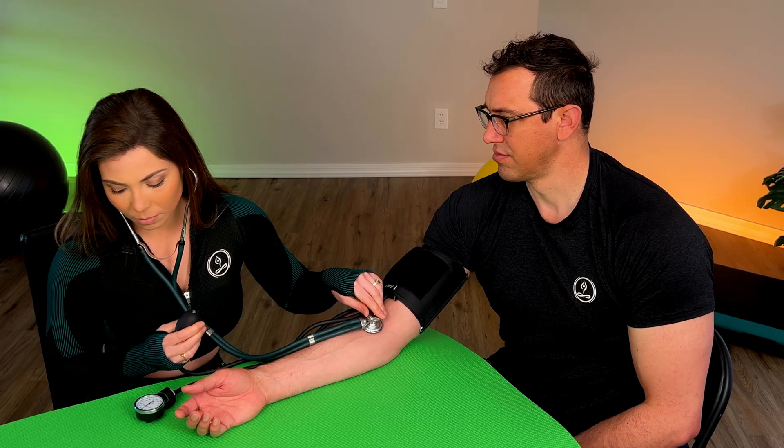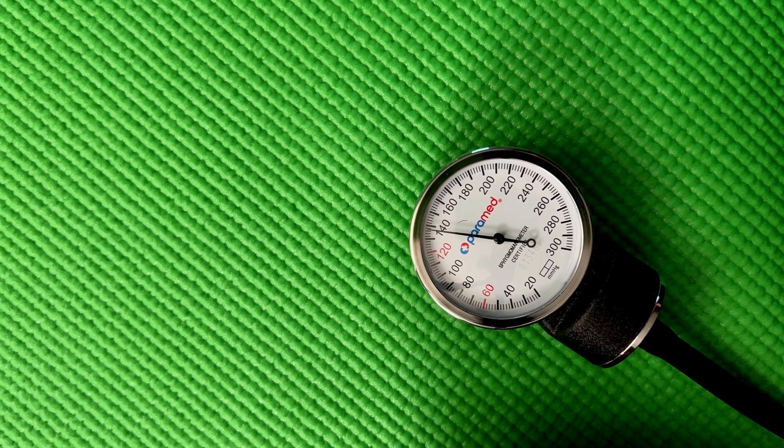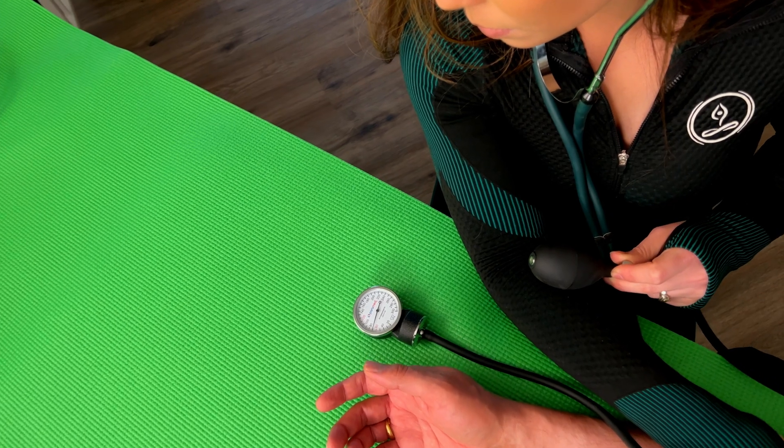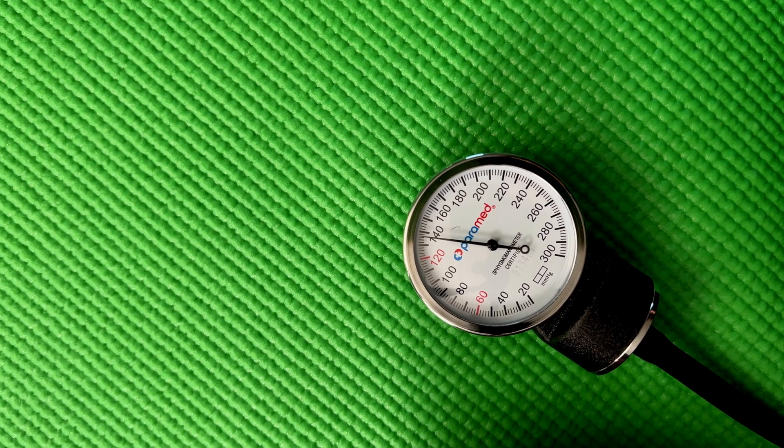The bottom line is you want to inflate the cuff until you don't hear any beat. One tip when you are inflating the cuff: make sure that the valve is actually closed, because if it is not, the air will just leak out and the cuff will never inflate. So if you're sitting there pumping it wondering why it isn't inflating, it's possible that the valve is open. Now you've got the cuff pumped up and the stethoscope placed on the artery. Now it's time to start releasing the air slowly from the cuff by unscrewing the valve very slightly and slowly. You don't want to do it all at once because then you're going to totally miss the reading — it must be very slow. A good pace of releasing the air should be about two millimeters of mercury per second. If you're releasing air faster than that, it's possible that you could miss hearing something.